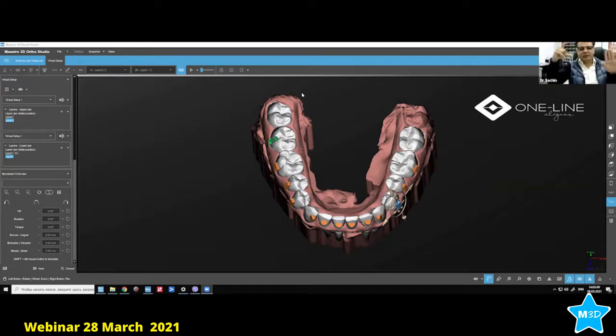So you need to see that also. You need to see the bone. You need to see the form. Maybe if possible, you can see the CBCT. You can see the shape of the root as well. A root which is conical, it'll move easily. If you have a figure of 8, oval, or with a depression on the root, it's going to move much slower. Okay, with time you can see all of these and you will get to know.